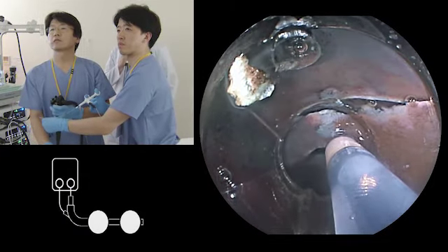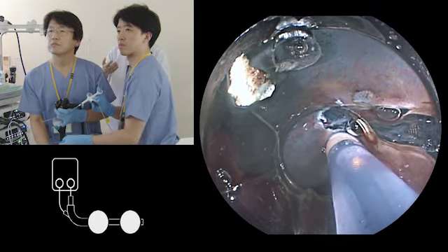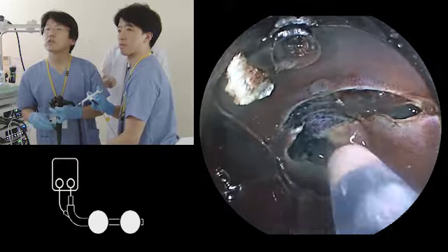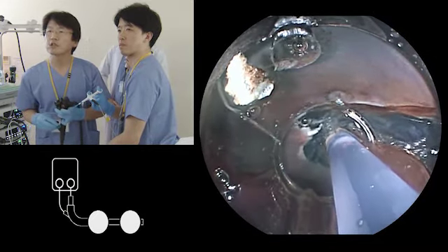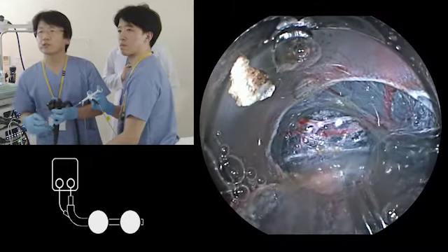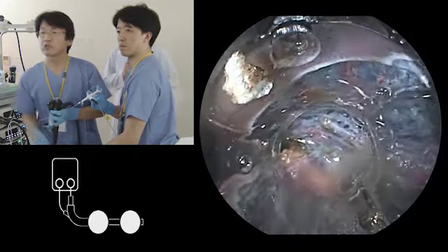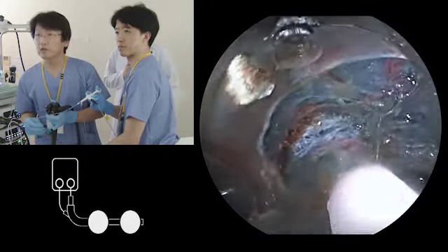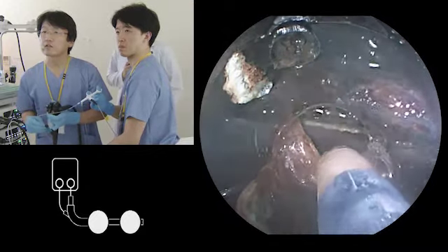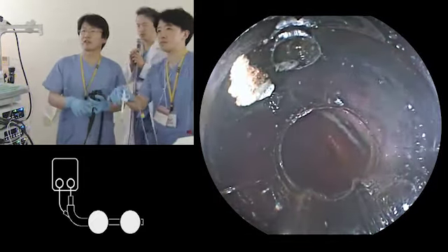Okay. So this pocket creation method procedure looks very simple and easy, but Professor Yamamoto does this procedure according to tips and strategy, that's why the procedure looks very easy. Yeah, I'm trying to make the procedure strategy not to make the ESD difficult. ESD is not a difficult procedure unless you make it difficult. Losing the submucosal cushion, causing bleeding and losing your endoscopic view, those factors make the ESD difficult. So this strategy will not make the procedure difficult. Yeah, excellent presentation. Excellent. Thank you.